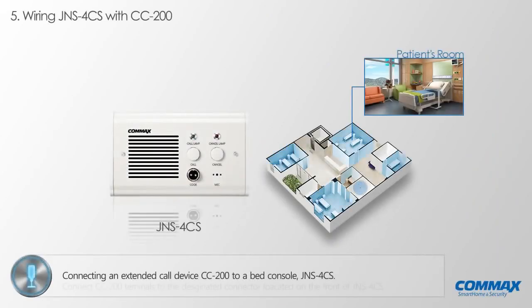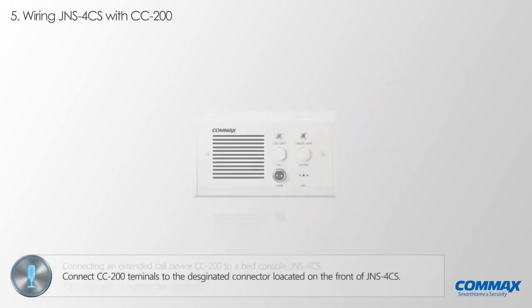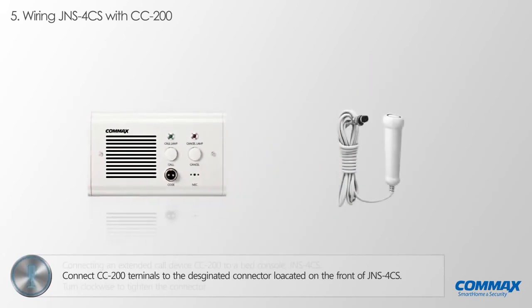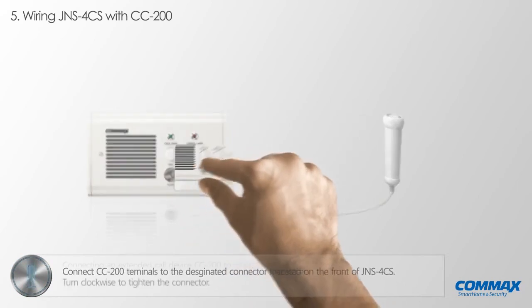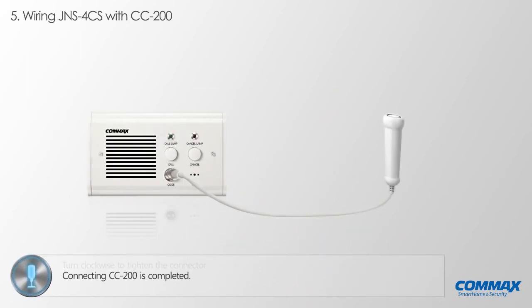We would like to show you how to connect an extended call device CC200 to a bed console JNS 4CS. First, please connect CC200 connector to the connector located on the front of JNS 4CS. Please turn clockwise to tighten the connector. Connecting CC200 is completed as shown above.